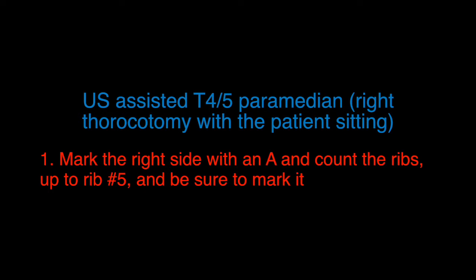Ultrasound assisted T4 to T5 paramedian right thoracotomy with the patient sitting.